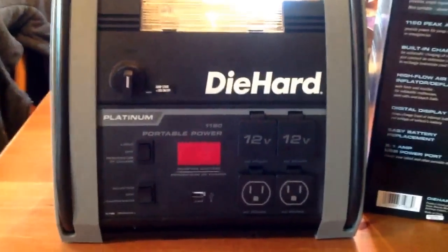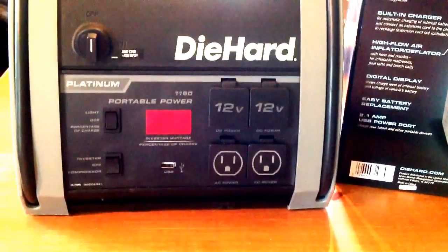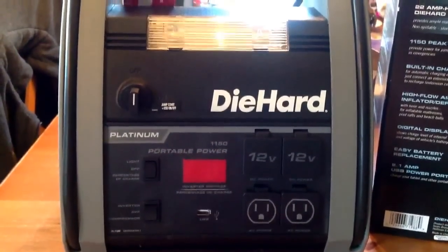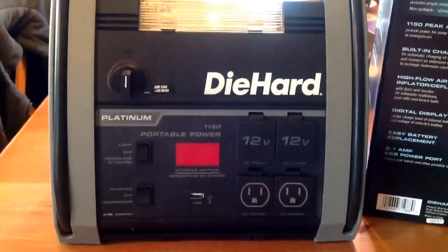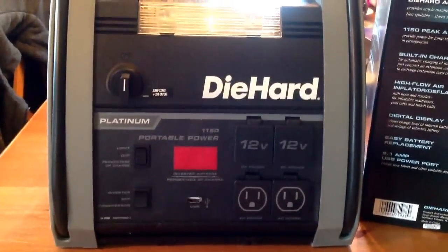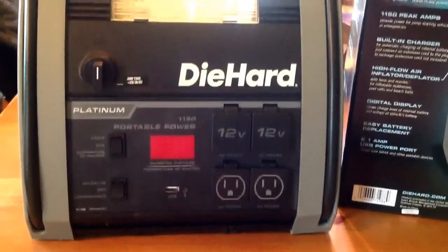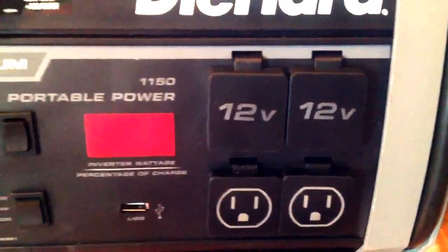If you have no power, alternatively, you could use a 12 volt jack over there to get a cord and plug that into your car cigarette lighter. And you could charge this thing as you're driving back and forth to work every day. So, for me, if there was a disaster and I didn't have electricity, I could take this device and put it in my car and bring it to work. Or I could plug it in at work if I have electric at work, or I could plug it into my car with the 12 volt jack over there. And as I'm driving back and forth to work, I could get my device recharged.